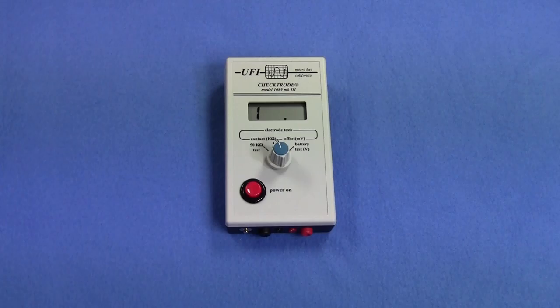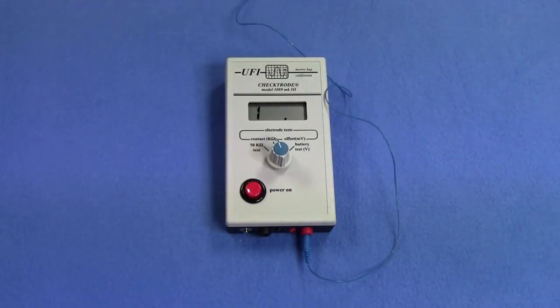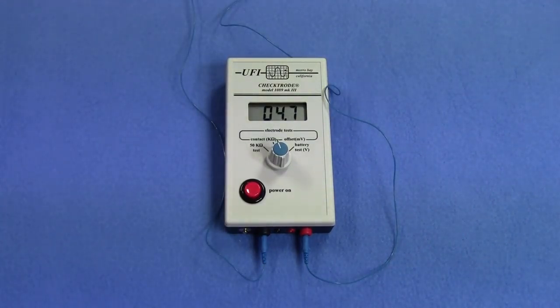It's important to check that all pairs of electrodes have sufficiently low impedance to ensure quality data collection. For each site there are three pairs: the electrodes along the muscle itself and each of them with the ground electrode. To check impedance, take the touchproof connector on the electrode and plug it into one of the ports on the meter, then take the second electrode connector and plug it into the second port. On this particular meter, set it to contact measurement mode. All pairs should have an impedance of under five kilo-ohms.